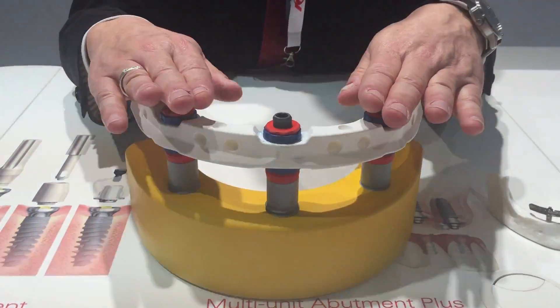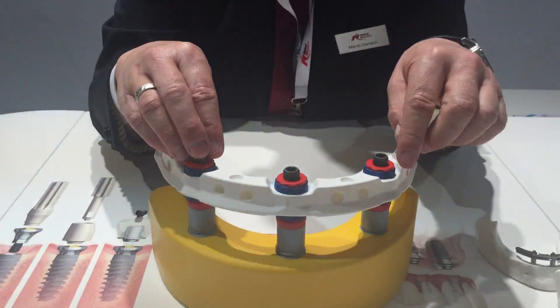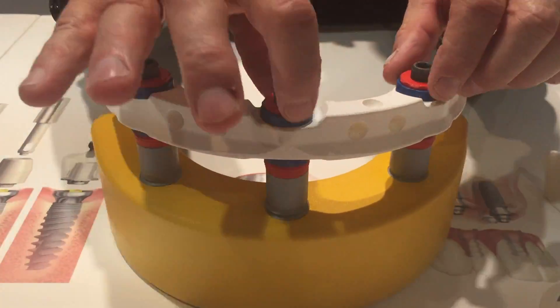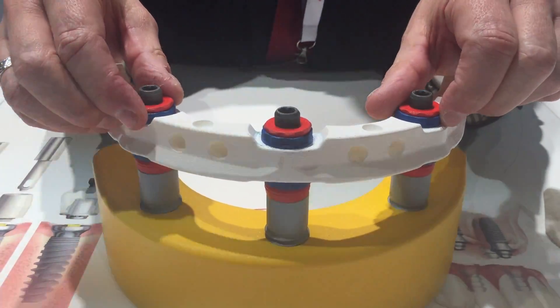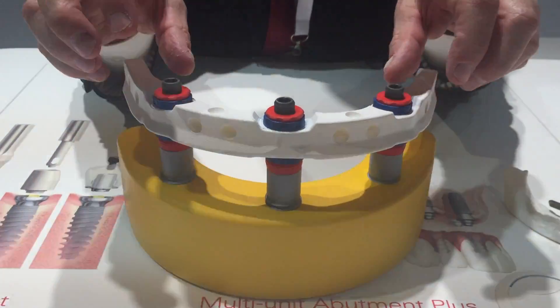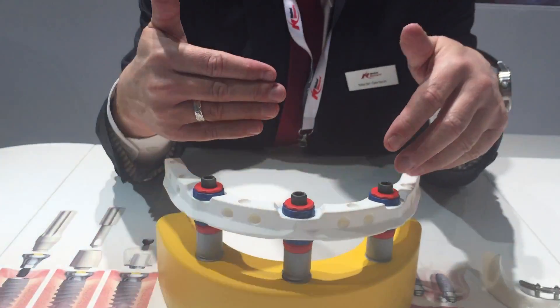And to fix this position according to the patient's implant position, what you can see here in red and blue — these discs — they need to be fixed with a light-curing resin. And if that is fixed, the bar fits passively without any force or tension to the implant. It gives better support and no stress to the implant or to the screws.